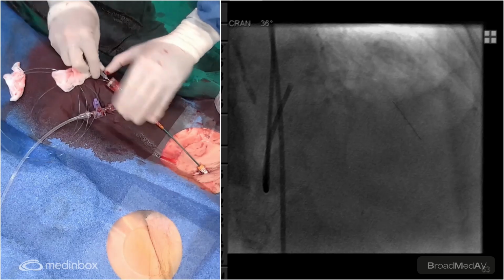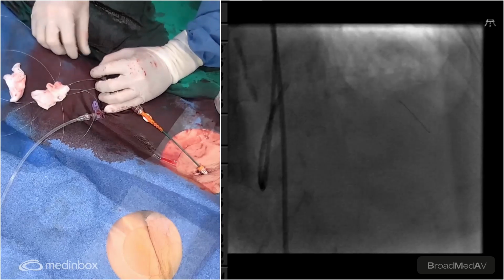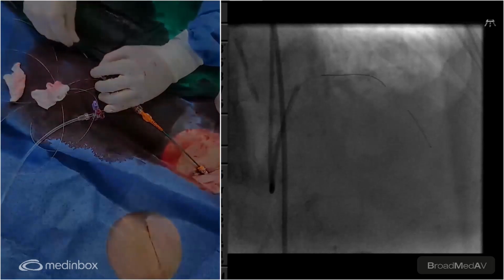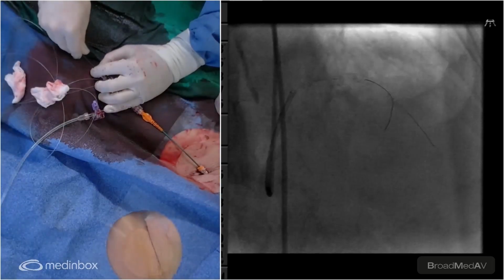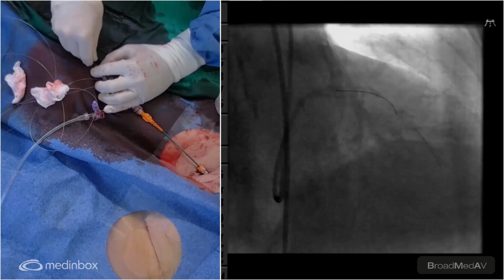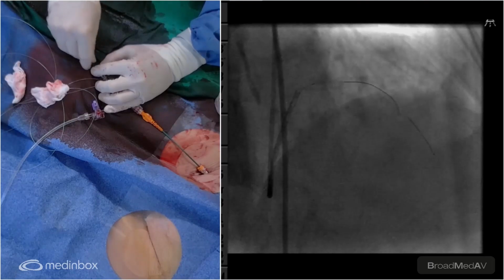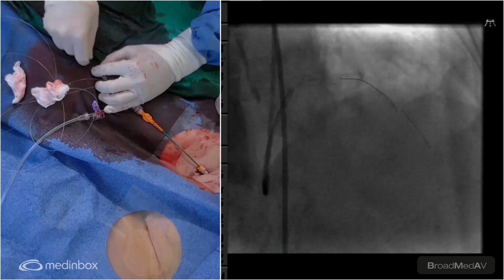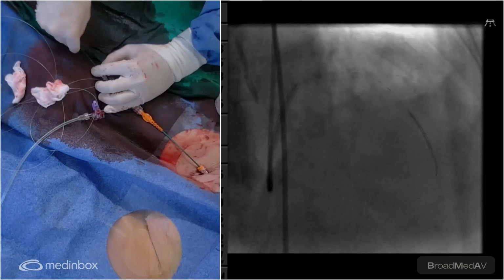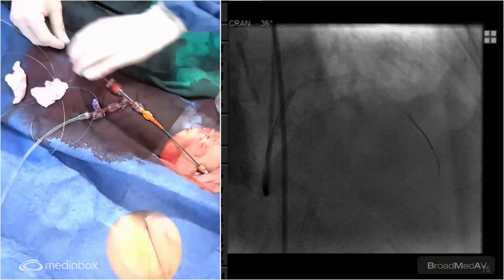Let's see whether we can start getting that on. Yes, he's got the intro tool still in. I think he does. I still feel it's hugging the wire quite a bit. One advantage of the balanced middleweight with the non-jacketed wires is that you can feel that tactile feedback. For sure, which you lose with some of the Pilots and Whispers.